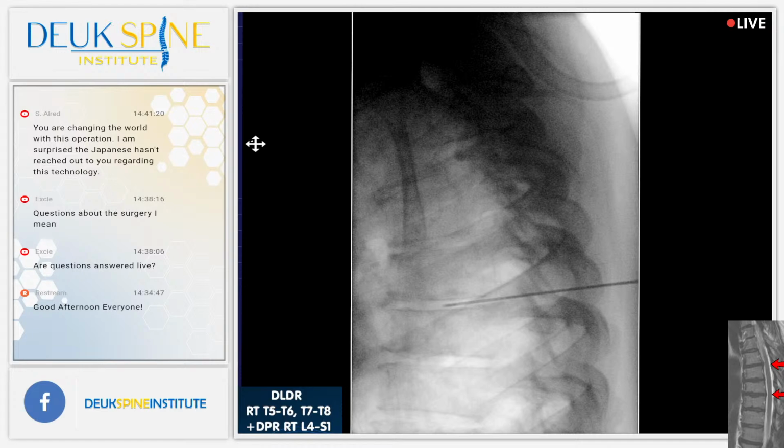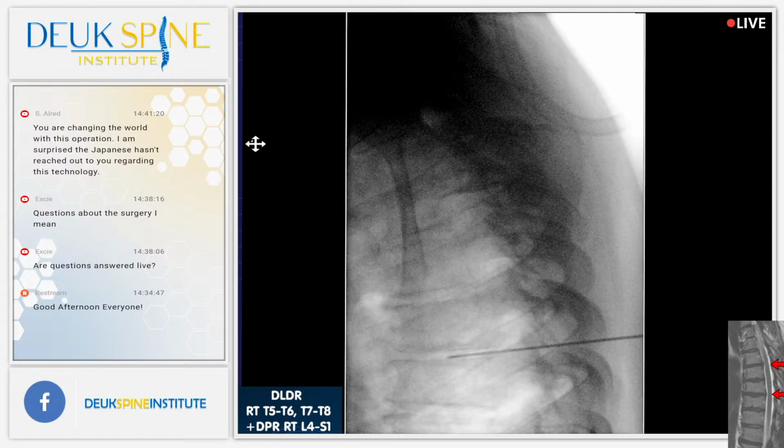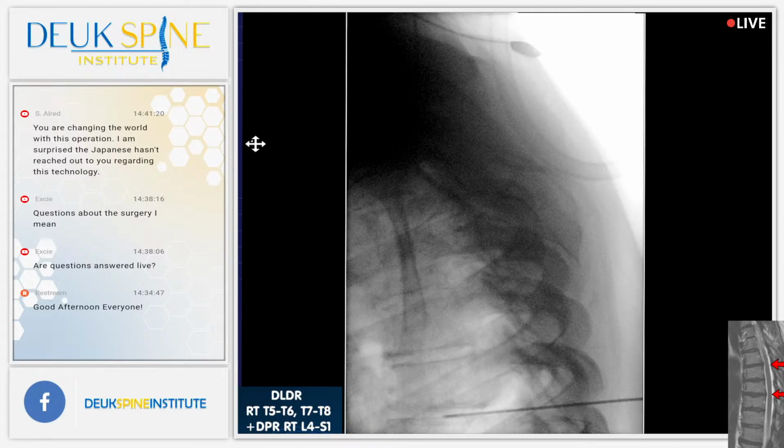Jordan, can you get us on the 5, 6 disc better? I need to see down the axis of the disc. What is that thing there? That's the scapula? That's just the scapula in the way. I think you're off on orbit, and I think you're off on wag. So let's try to orbit and wag it.